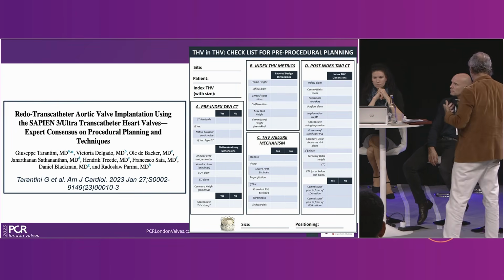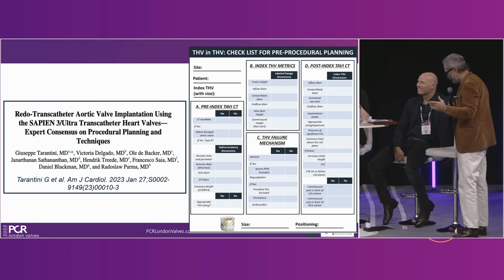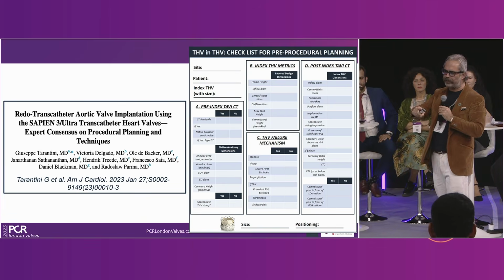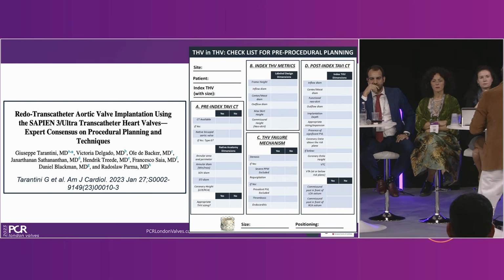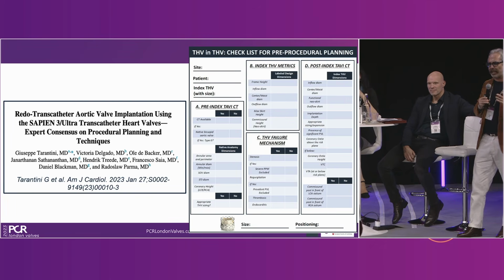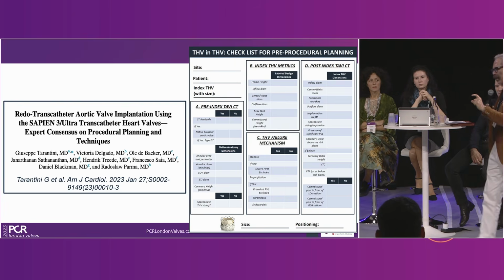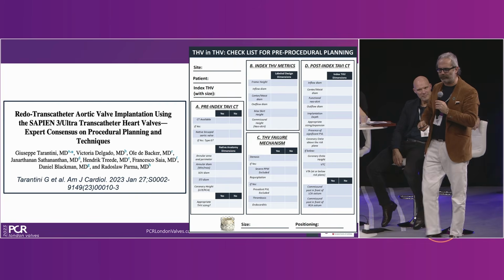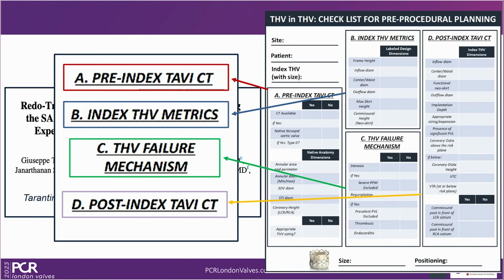So there are different manuals. Clearly I show this because I have a clear conflict of interest with this paper, but actually the point is, for me, it's useful because you can download this checklist. You can download this from this paper and apply it in the everyday practice of the lab, where you can collect in a standardized way all that is needed for the final valve choice, sizing and positioning of the valve. So actually it seems very easy, but it's not complex at all, because there are 4 main chapters.